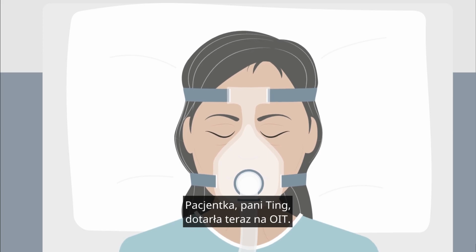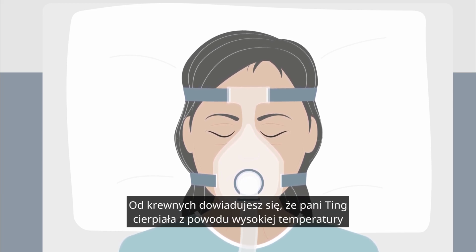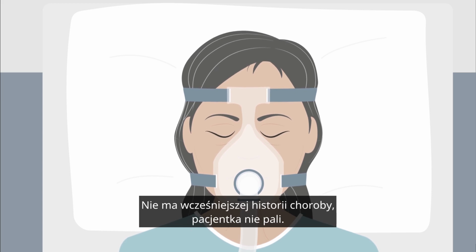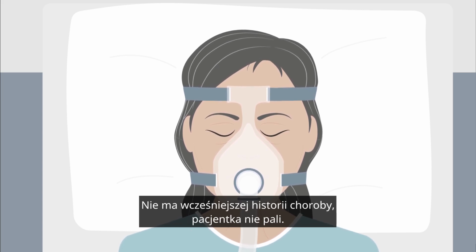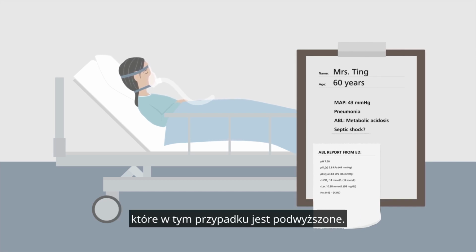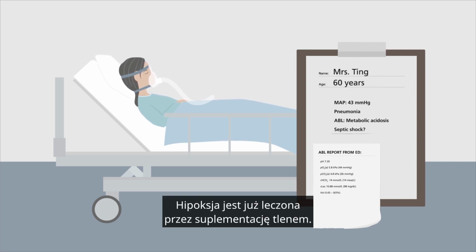The patient, Mrs. Ting, has now arrived at the ICU. From relatives, you learn that Mrs. Ting has suffered from high temperature and productive coughing for 3 days. She has no prior medical history, and she's a non-smoker. The ABL patient report also gives you the lactate level, which in this case is increased. This is probably caused by hypoxia and hypovolemia. The hypoxia is already being addressed by supplemental oxygen.